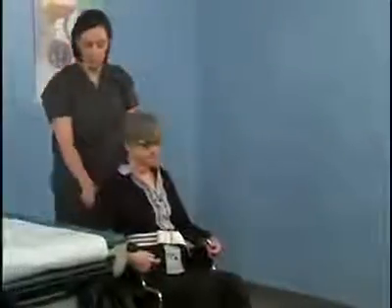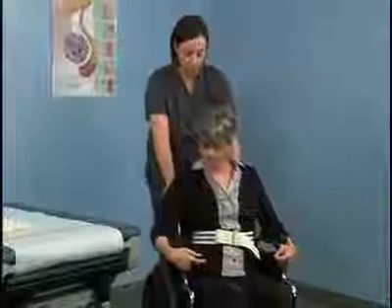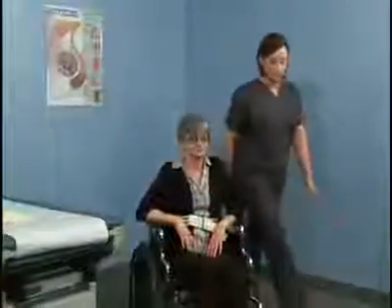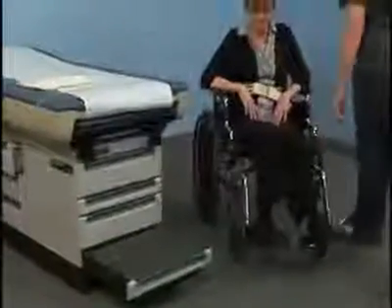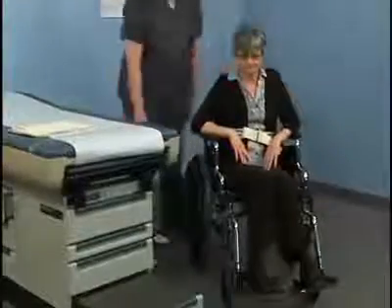With the patient's stronger side next to the examining table, position the wheelchair at a 45-degree angle to the end of the examining table. If the table is height adjustable, adjust it to the same height as the wheelchair or slightly lower. If the table is not height adjustable, such as the one you see here, pull out the table's footrest.